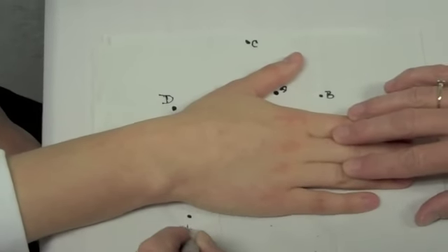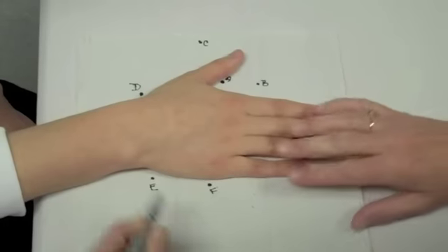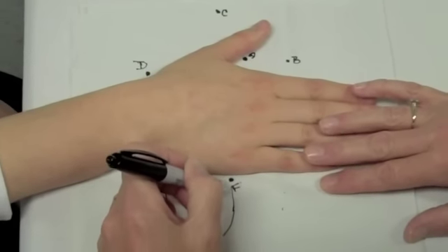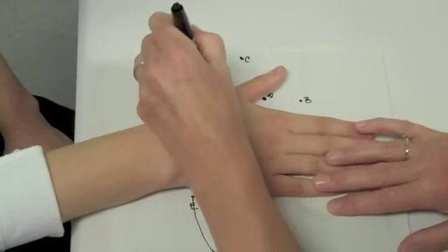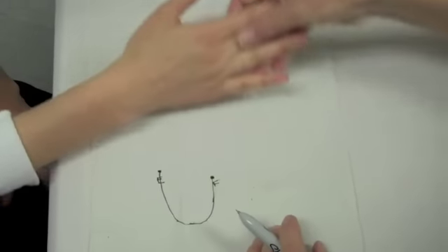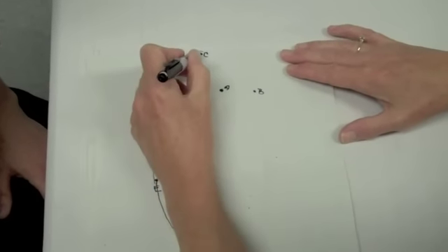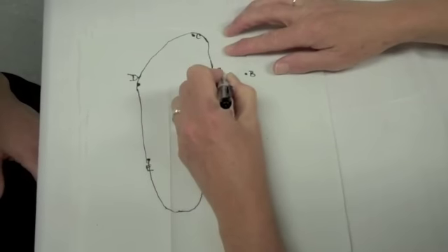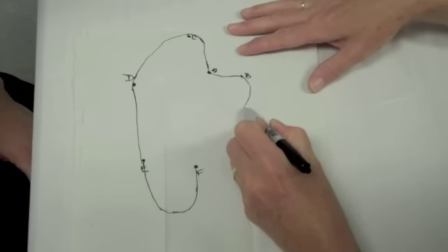Mark an E at the ulnar aspect of the wrist at the CMC joint. Mark an F at the base of the fifth metacarpal. Connect points E and F with a curved line. Connect points D and C with another curved line. Have the patient lift up their hand from the pattern, then connect points D and E with a straight line. Next connect points C and A, and points A and B. Curve the line outward and downward to connect points B and F.